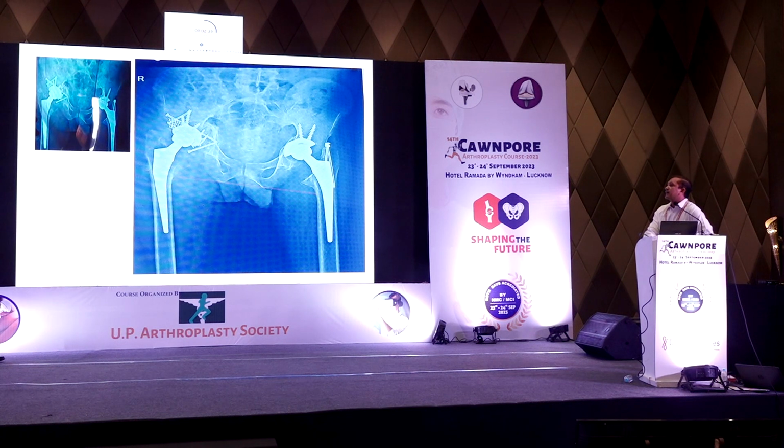Sir, there was no bone graft actually. Whatever was left, you have to use. And I have used some hydroxyapatite and bone substitute there.